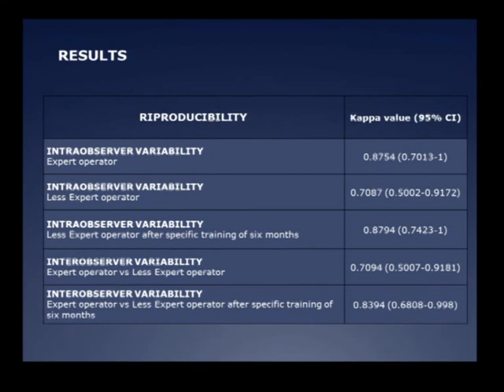It's fundamental that the examiner is a specialist in this case. It's not so easy. But the major problem is, as a specialist, usually I review images from other colleagues. There is, for example, a typical nodule not described by the colleague. There is a picture of the nodule in the retrocervical part of the uterus, but without description.